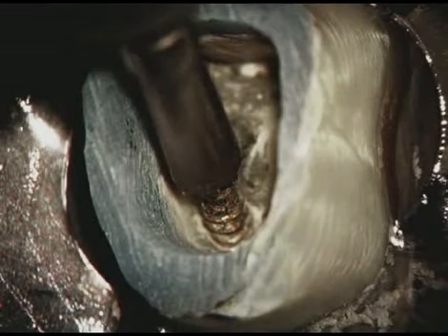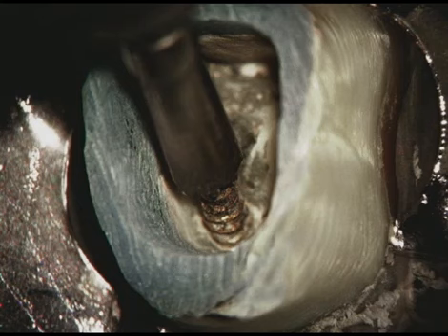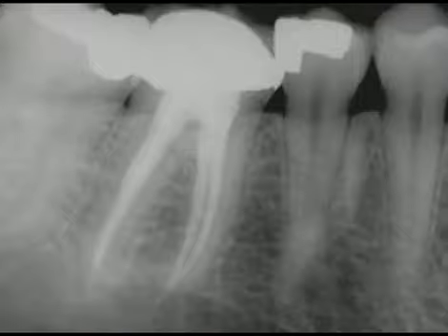Following isolation and initial reentry, a clinical photograph demonstrates a tap initially forming threads and being drawn down to tightly engage the post. This paves the way for the torque bar, which is then utilized to back the post out of the canal. A post-operative radiograph shows the re-cemented crown and the retreatment efforts.